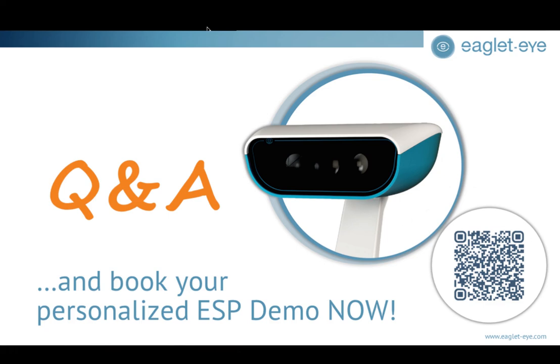Right, right. Yeah, I would say that it seems like around 70 to 80% of our ESP users use proparacaine a fair amount of the time.